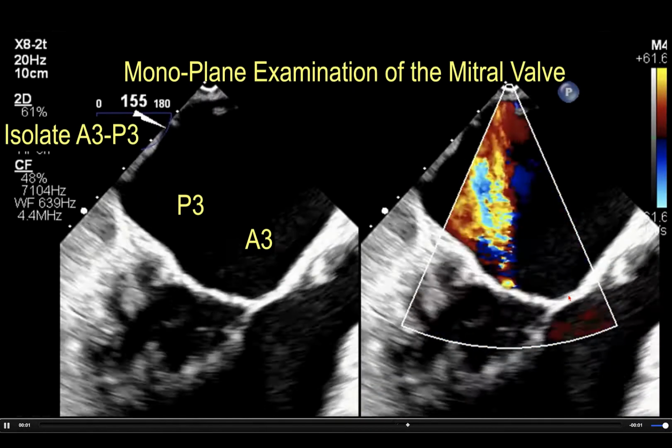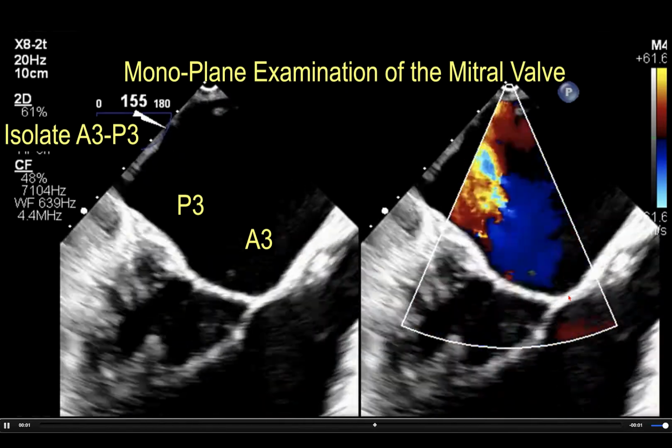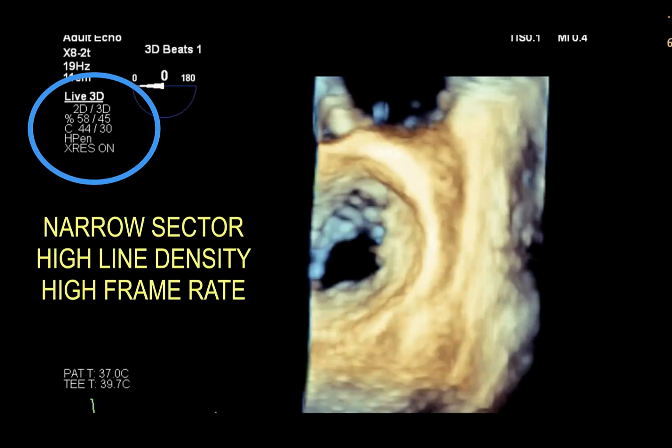Okay, so we've determined on 2D anyway that this is more than likely a dropout. Now, going back to our 3D image, is there anything we can do in terms of knobology to alter our settings to try and determine even further if this is a true dropout we're seeing or a perforation?